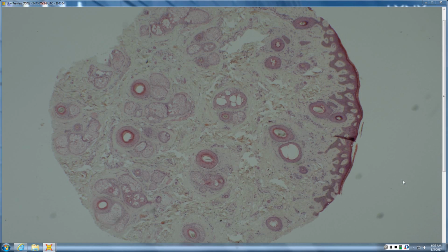And what you also don't see, because that's usually very important when it comes to hair, is from scan you're not seeing tons of inflammation, not tons of neutrophils or lymphocytes anywhere, and you don't really see tons of scarring either, really any scarring. Now of course with hair conditions there's a lot of overlap, so it is possible to have a scarring process and pattern alopecia, but in this case you're not seeing a lot of those features.